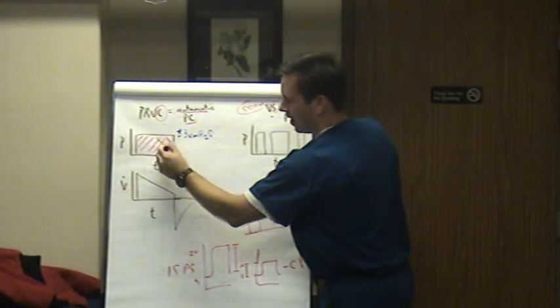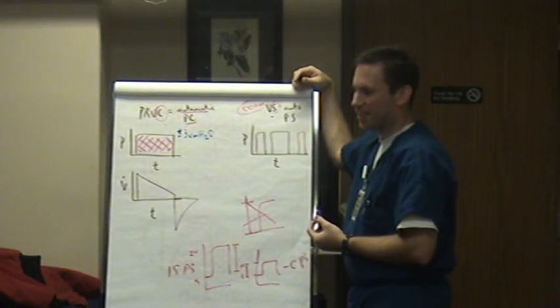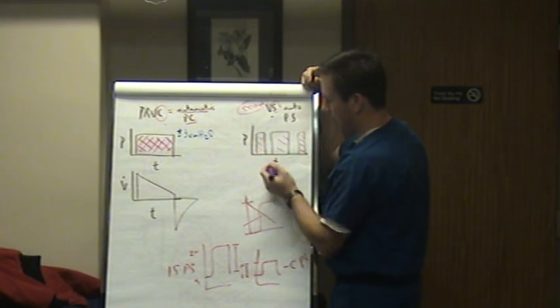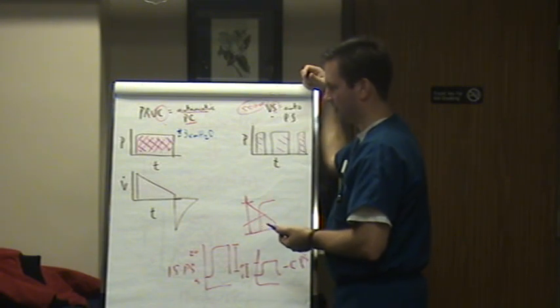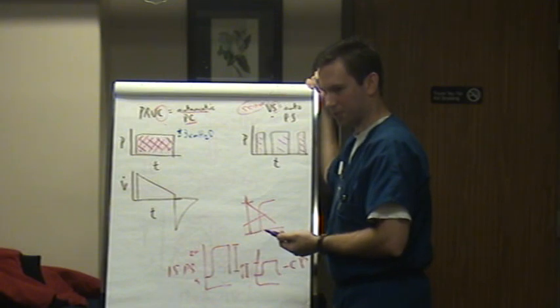And what's the definition of that? What's the definition of the surface area underneath that pressure waveform? Yeah. That's the mean. See, what they did is you woke them up and look how they're breathing. See, no mean. Not a whole lot of mean, is it? So they lose that, so they desat. So you say, well, let's just knock them back out and put them back on PRVC. Well, every time you give them a sedative or a paralytic, their blood pressure hits the floor.